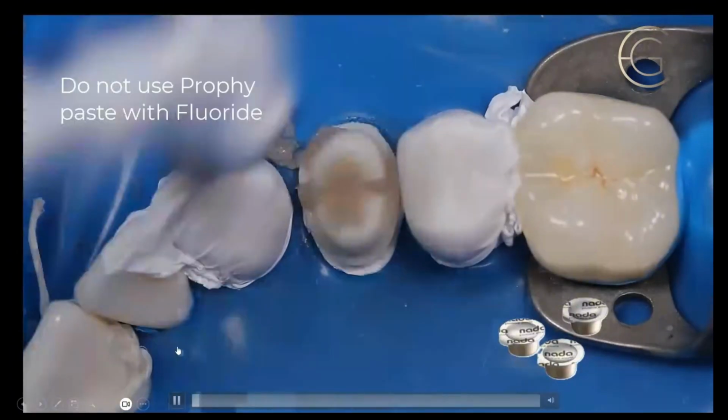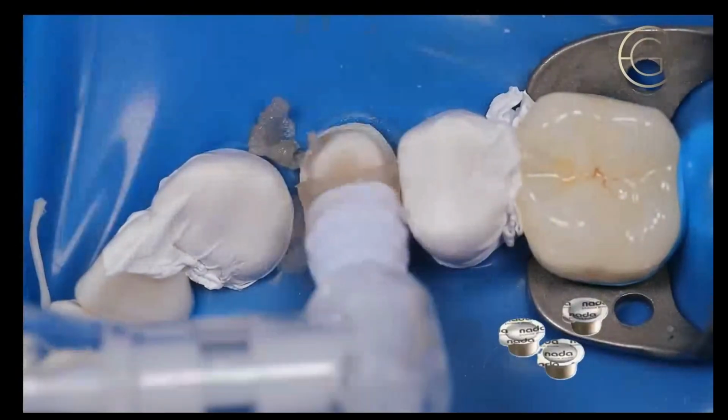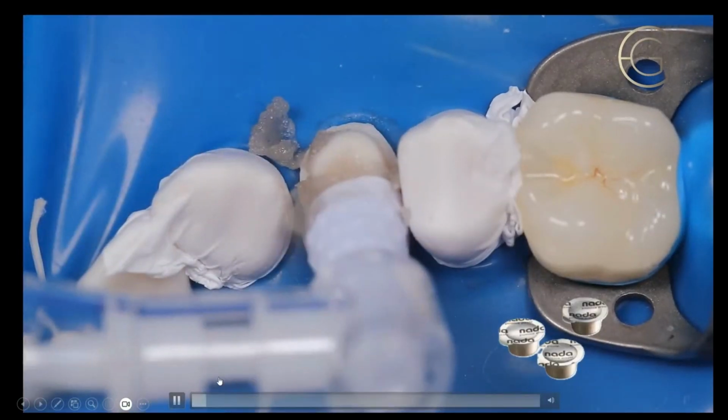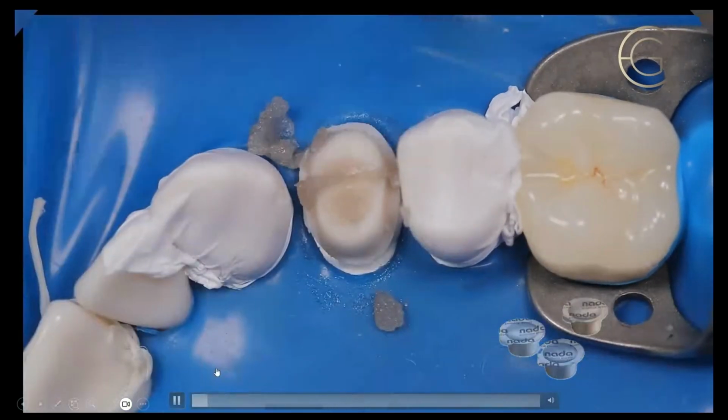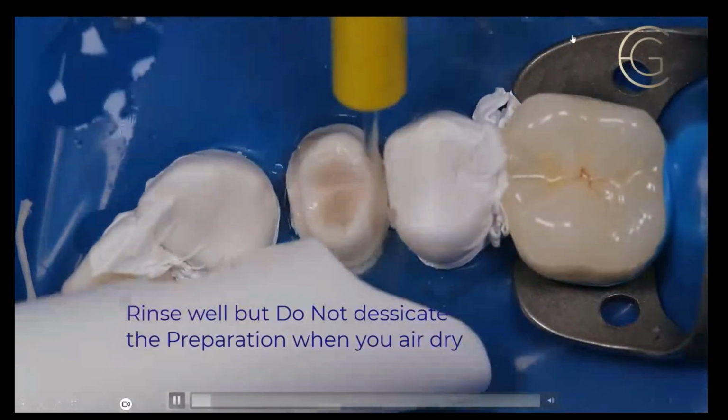So this is a pretty traditional technique. I just showed this at University of the Pacific. This is what they're doing, part of their thing. I'm taking so much time on this. It's like I'm making love to the tooth. It's ridiculous. Just clean it off, have it good, rinse this off, and you've got a really good situation here.